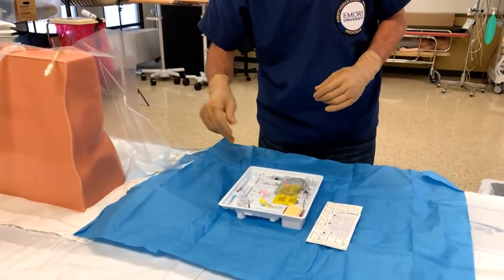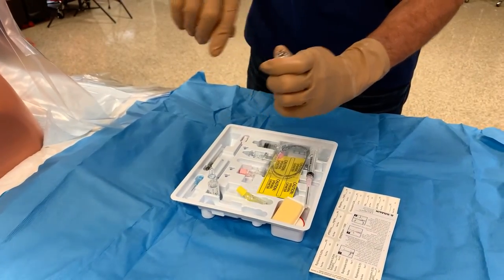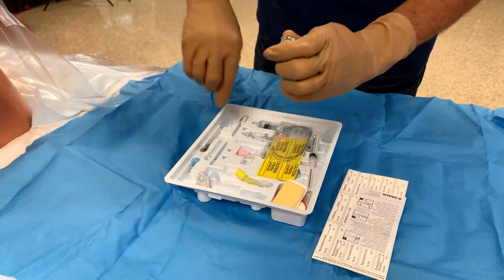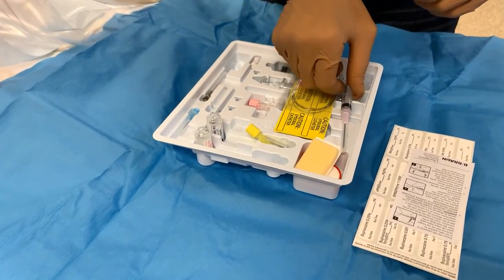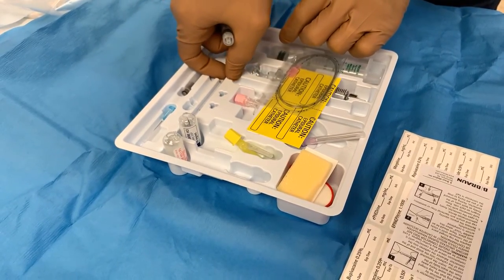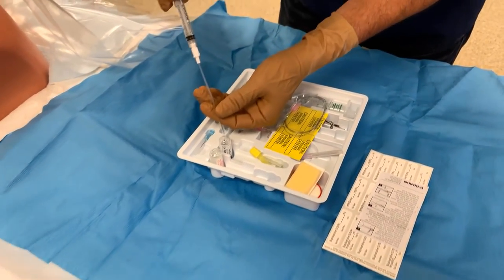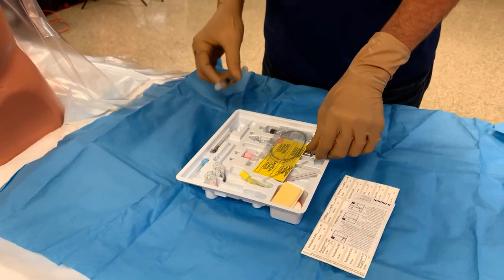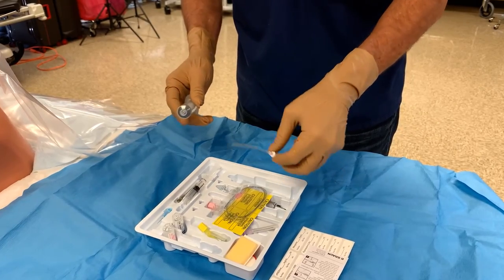Our next step is to get our medications drawn up. We have some one percent lidocaine for our skin wheel. We'll use a filter straw, get that drawn up, and we can also go ahead and get our test dose drawn up as well.